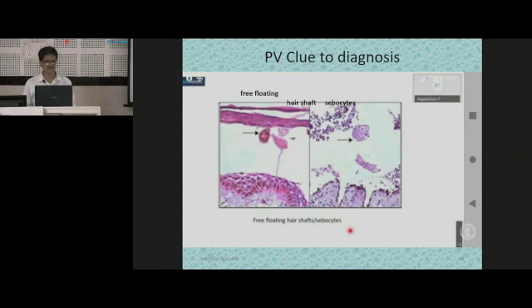So this becomes the pointer to this condition. Just beneath this left-hand side diagram, you see that there is multilayering. Some amount of reepithelialization possibly has occurred, or this may be at the edge of the blister. At the edge of the blister, you can see multilayering. Normally one would expect a tombstone appearance here, just as you are seeing over here. But here, these are very important. These will give you a clue that in fact the split is occurring at the suprabasal location.